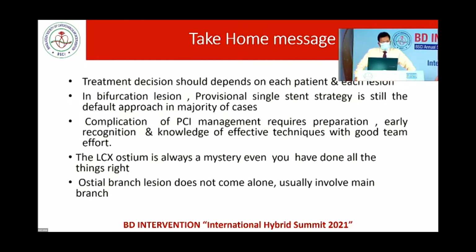Let me tell you, CT angio first. I did this whole chapter with Dr. Narula about CT angiogram in his book. There is a separate kernel to use for evaluation of CT angiogram. You have so many struts, you may not be able to see them because of the blooming artifact. CT angiogram works if it is a 4.0 stent with thin struts. Here we have a lot of mumbo jumbo, and we may not be able to see it very well.